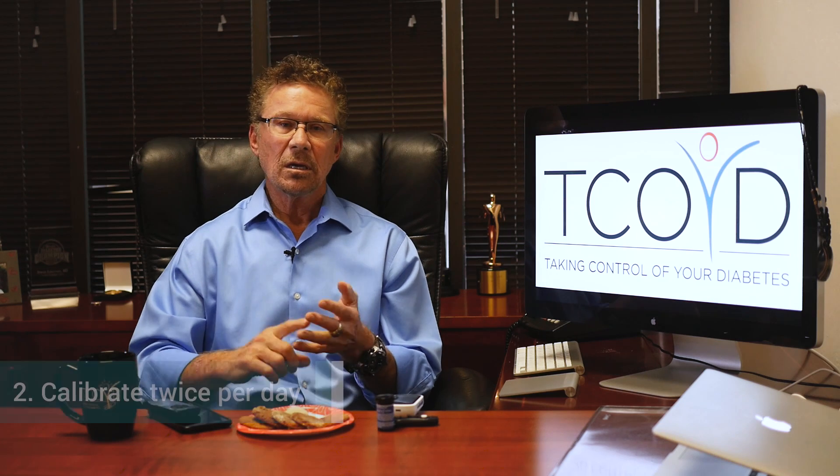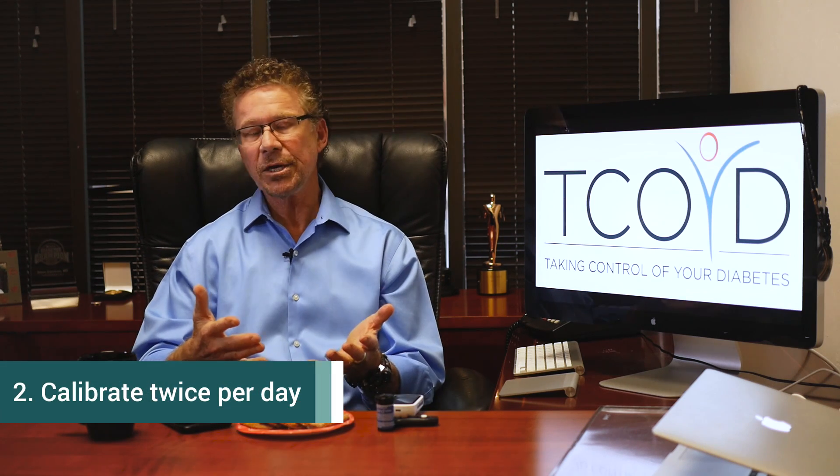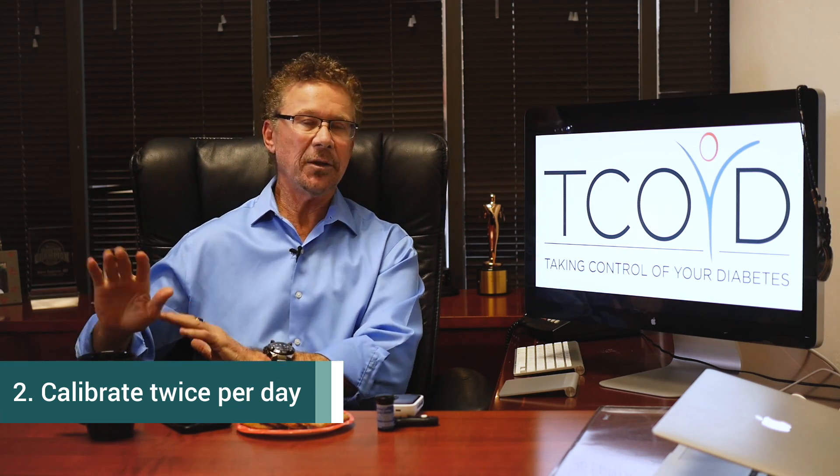Number two: you've got to calibrate twice a day. Future generations will not require calibrations — even further down the line, we're going to have a factory-calibrated Dexcom CGM where you never have to calibrate. But for now, you've got to prick your finger twice a day and enter that number into your CGM. The one thing that's extremely important: you've got to make sure you get the most accurate glucose test that you can to calibrate.